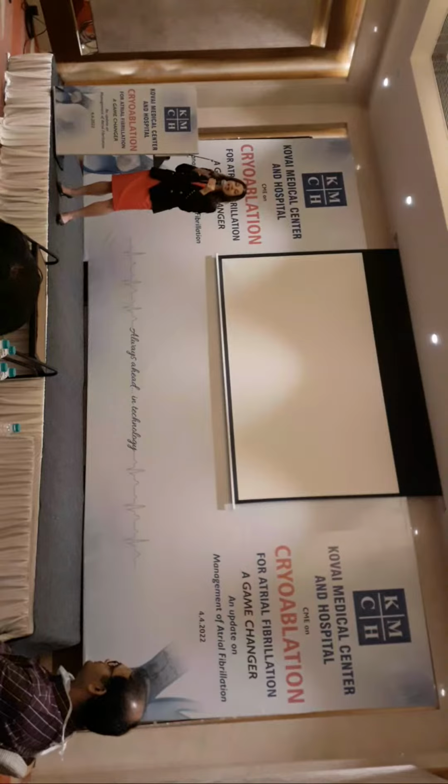Today I assumed that maybe they wouldn't be set up for CMAP. They were totally set up for CMAP, and we had CMAP during these cases. And so we watch both. Believe me, none of these patients today were morbidly obese, so the whole table kind of shakes with the phrenic pace. And the CMAP was right on the screen for us. So it's two great ways.